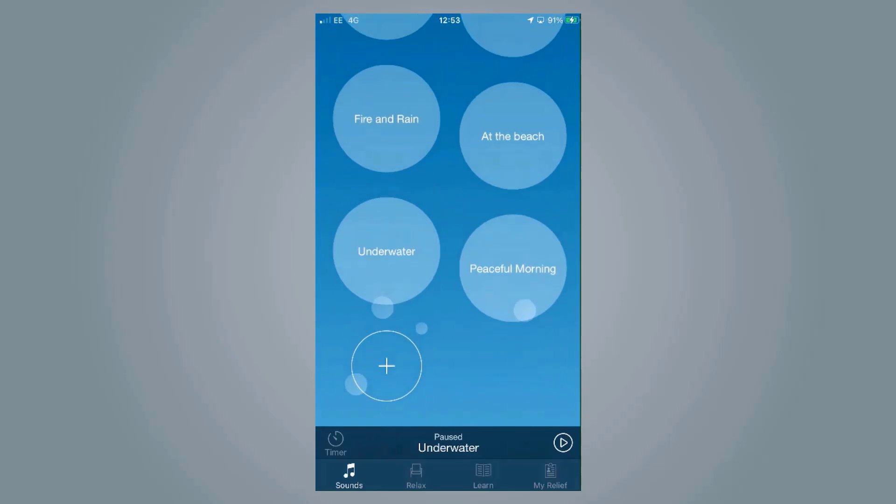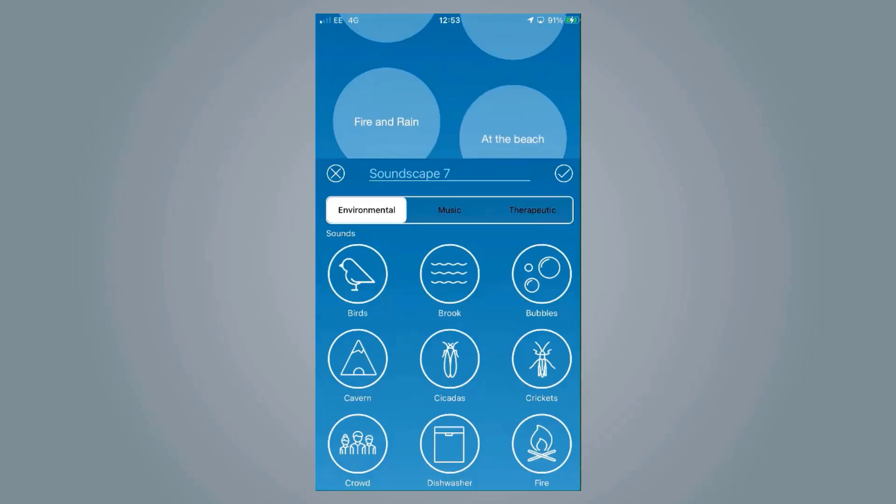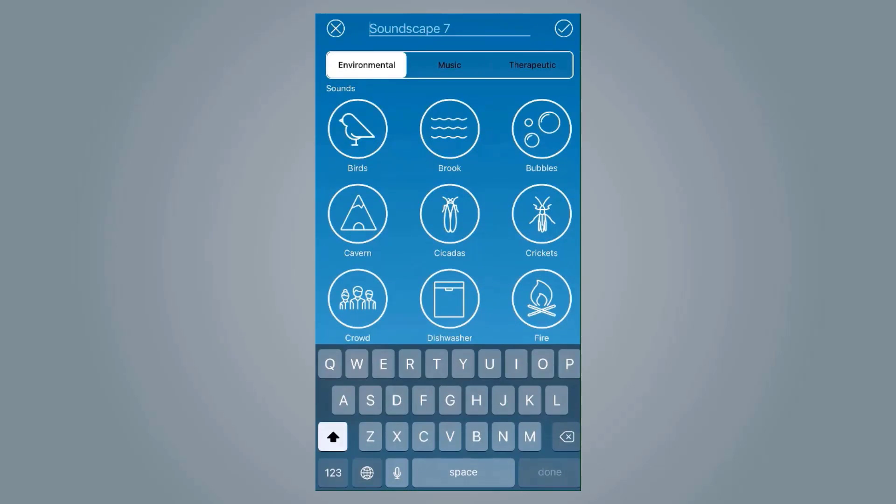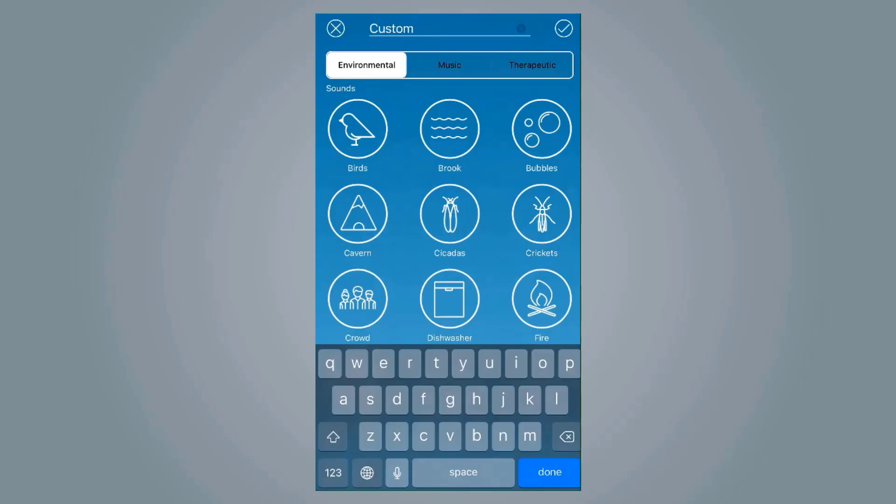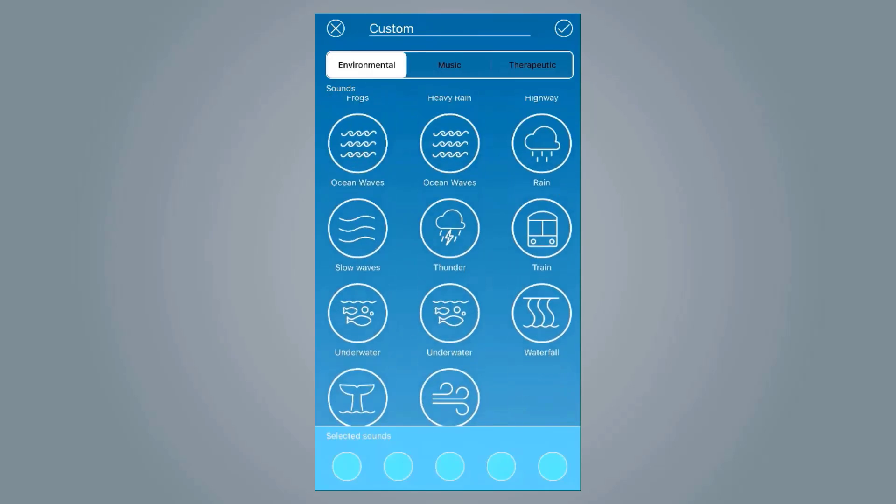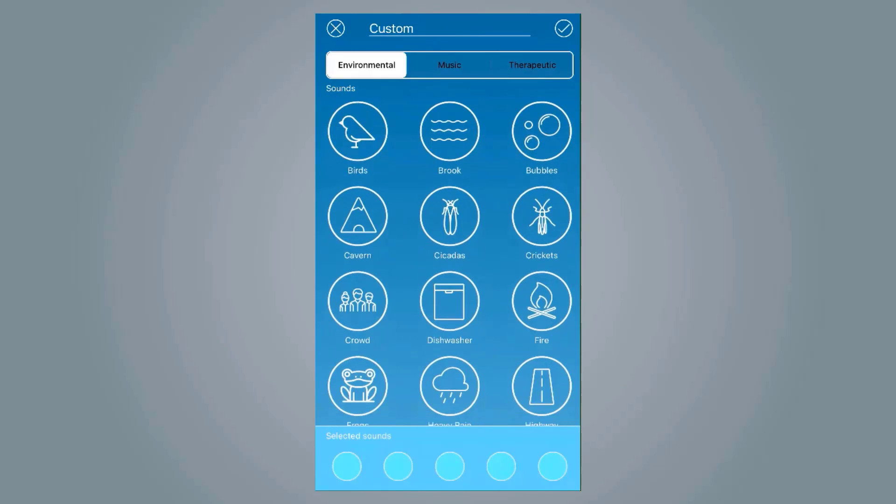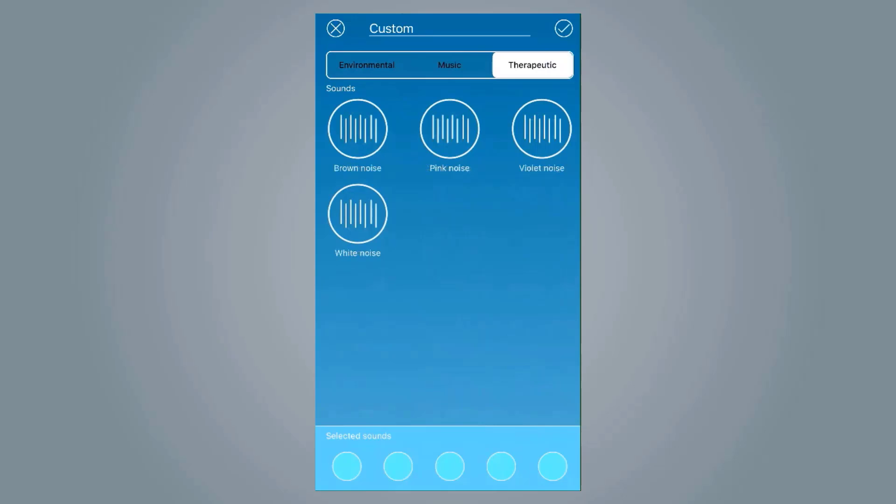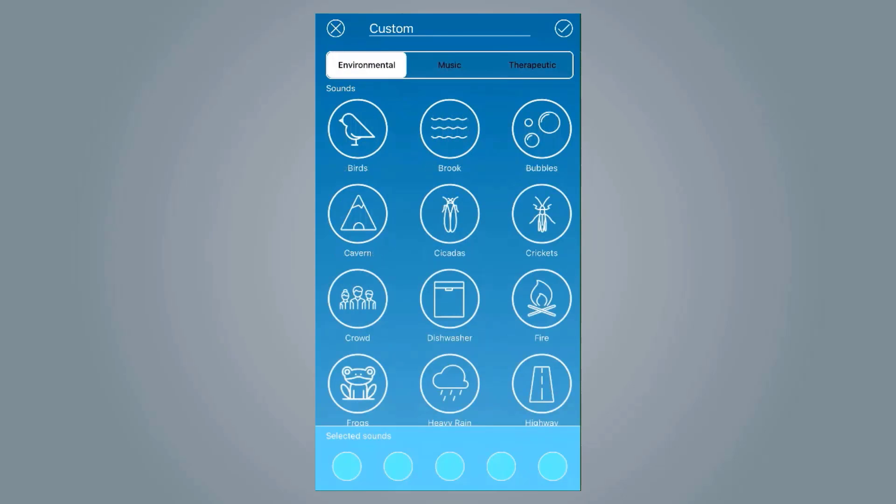If you scroll, you can add your own custom sound and even give it its own name.